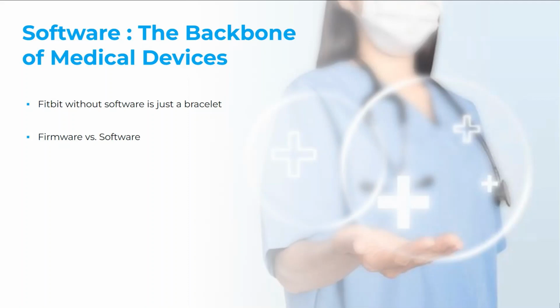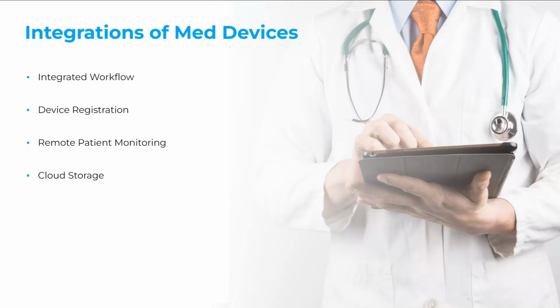And again, like I mentioned a pacemaker in the previous slide, the software that operates a pacemaker isn't medical device software. That's the medical device of the pacemaker itself, because it has a function it does once it's installed, and it's going to keep doing that function. There's not software that's driving and saying what's going to happen in the pacemaker. The medical device is the pacemaker. So sometimes it might get a little murky, but I hope it's a little clear.